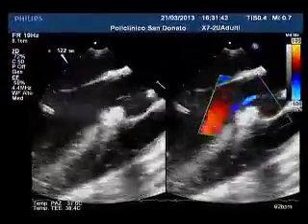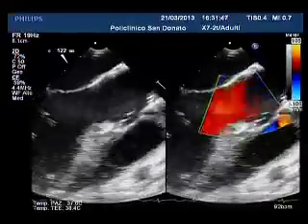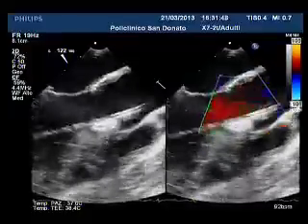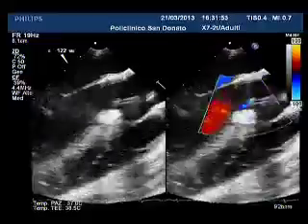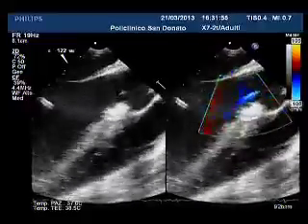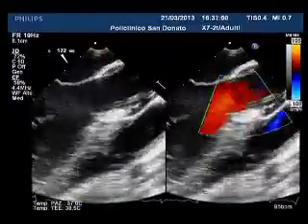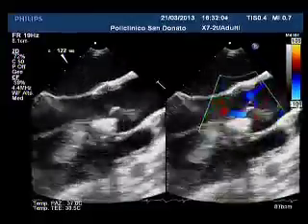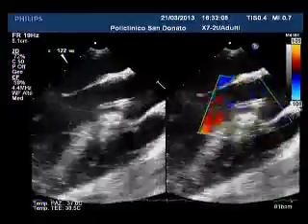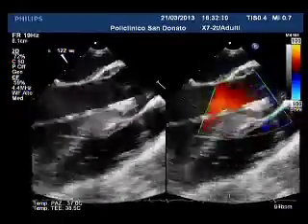Okay, perfect. Great. So you see the device sitting right there, and it's a very trivial AI, but I think it's because you have another catheter across the aortic valve. Let's go live, fluoro. Okay, so we are there. So what I'm going to do here, let me do the cine. You can leave this here. I'm going to now slide tension and see if I can deploy the device.